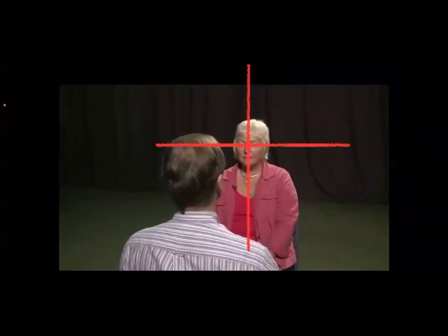should be the light reflex, in addition to the swinging light test. Okay, a swinging light test, you will shine the light from the right eye to the left eye to the right eye again. The normal response is usually whenever you shine the light in the pupil, it will constrict, right? Sometimes when you shine the light back on the pupil, it will dilate instead of constriction.